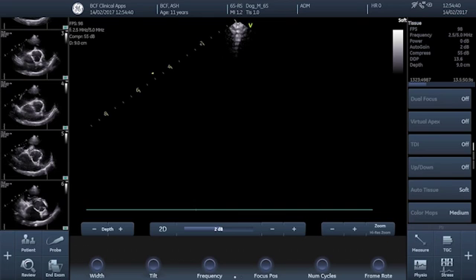Welcome to the first video in our cardiac measurement video series. In this video we're going to look at how to measure or calculate the left atrial to aortic root ratio, or LAAO ratio. Please note that the videos in this series are intended as how-to guides and we're not going to discuss the indications for making the measurements in the first place, nor are we going to discuss interpretation of the results and their implications.